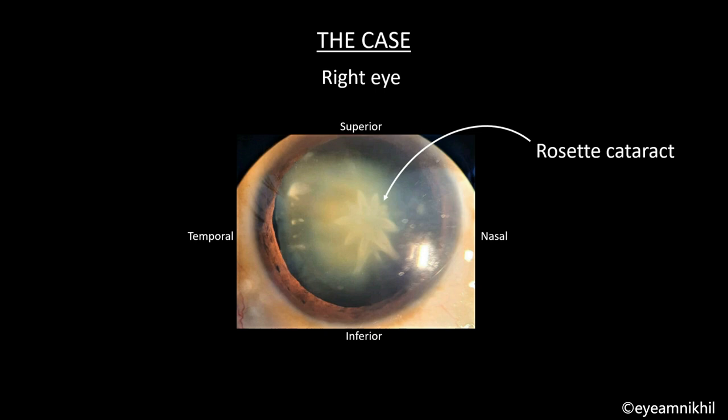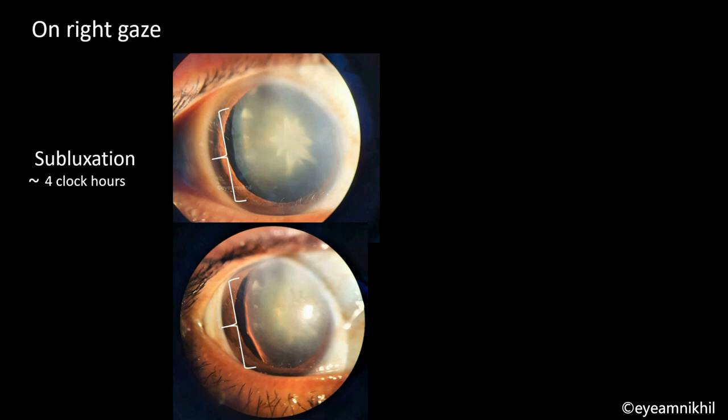In primary gaze, we can see a rosette cataract and around 2 o'clock hours of subluxation in the temporal area. On right gaze, the subluxation appears to be around 4 o'clock hours, from 7 o'clock to 11 o'clock. It is therefore always important to assess the degree of subluxation by asking the patient to look in the direction of subluxation.